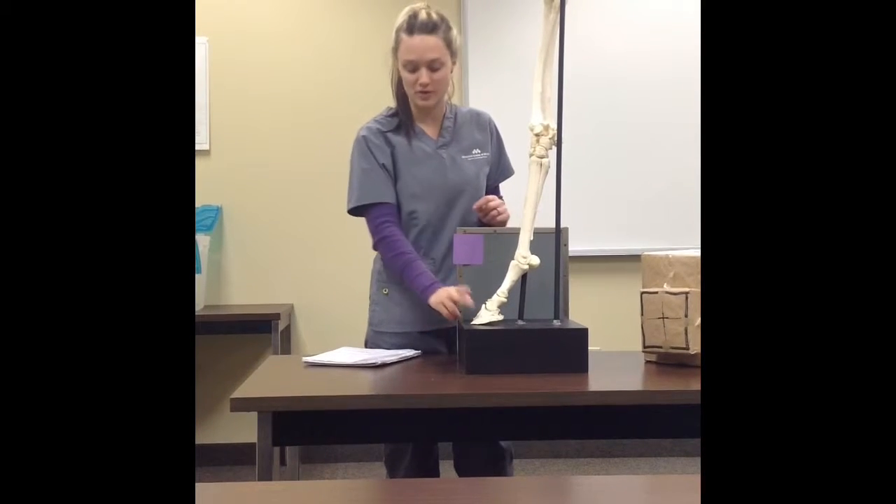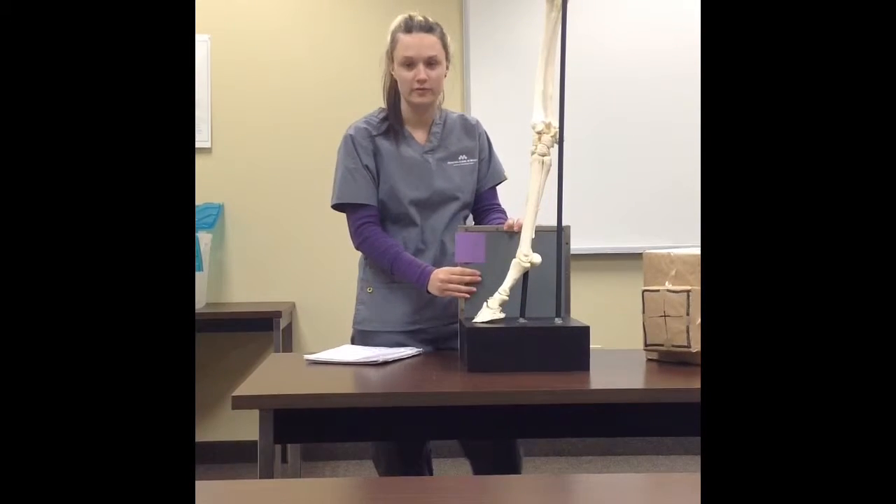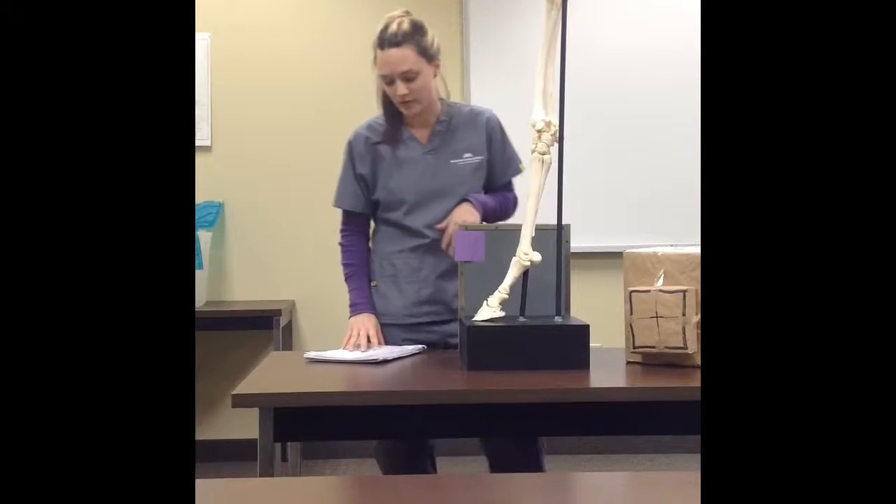This is the distal phalanx, or P3 view. The equipment you're going to need is a lead apron, thyroid shield, dosimeter, a plate with cassette and film, your portable x-ray machine, and two wooden blocks for this view.